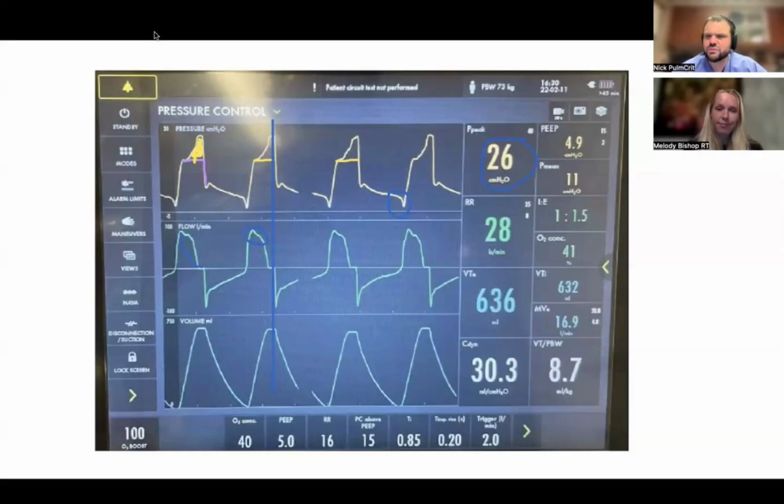You know what I mean? Because the patient's going to be breathing on their own. So just use pressure support and be done with it. Why exactly switch between two? I just don't see a role for it, I think, is really what it comes down to. Yeah, exactly. No, I think that sums it up well.